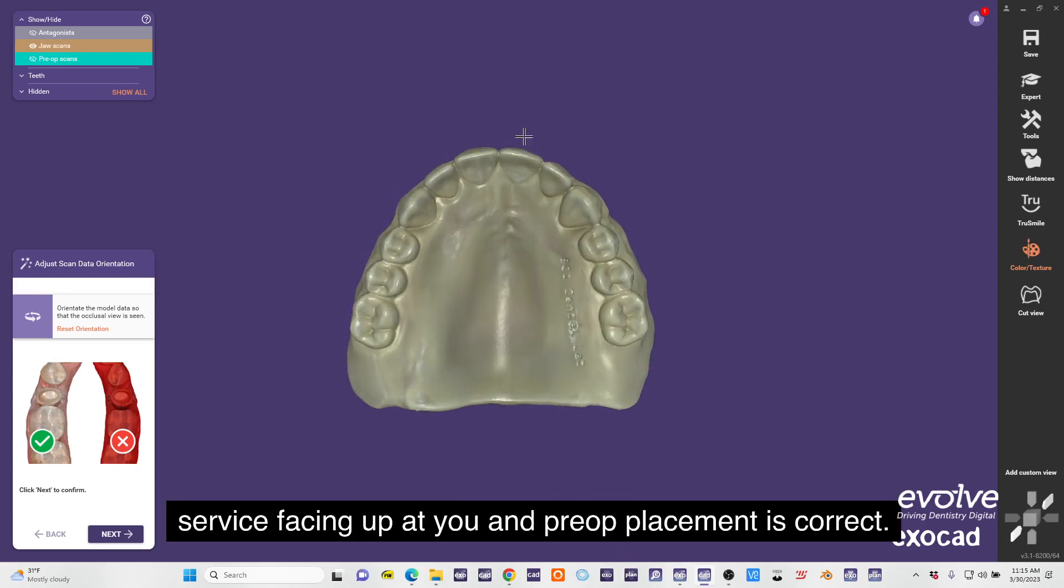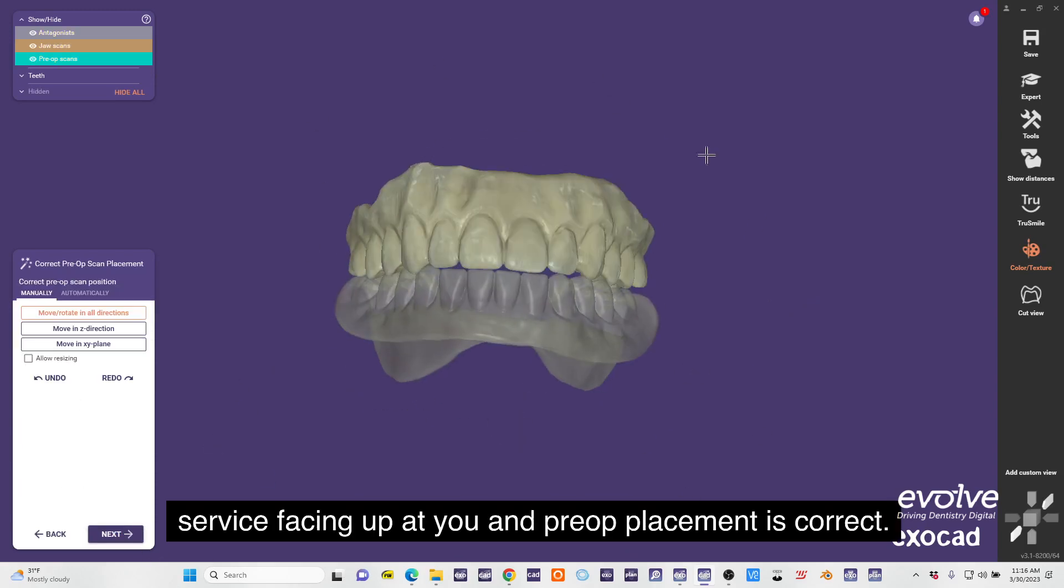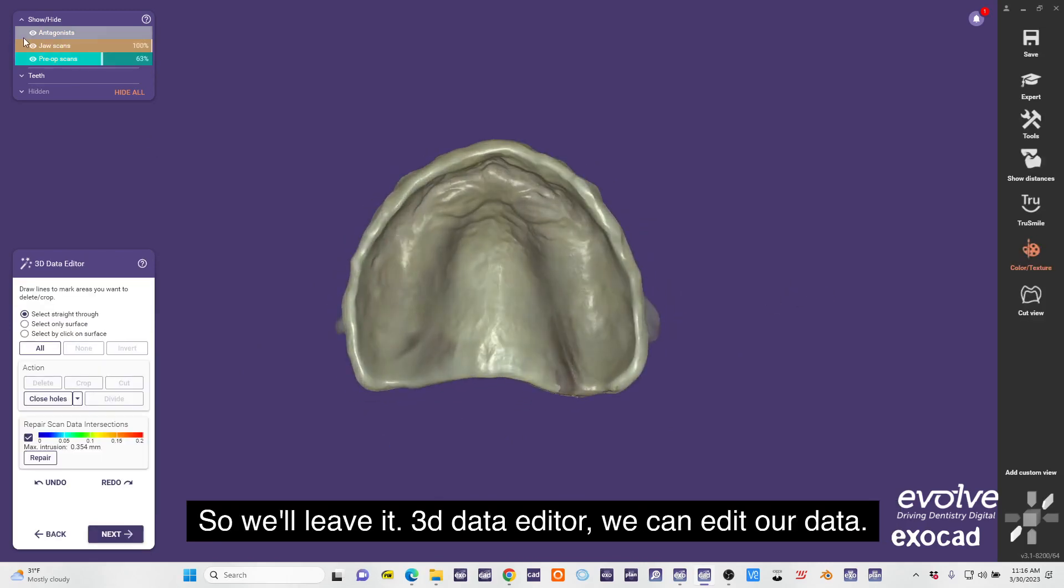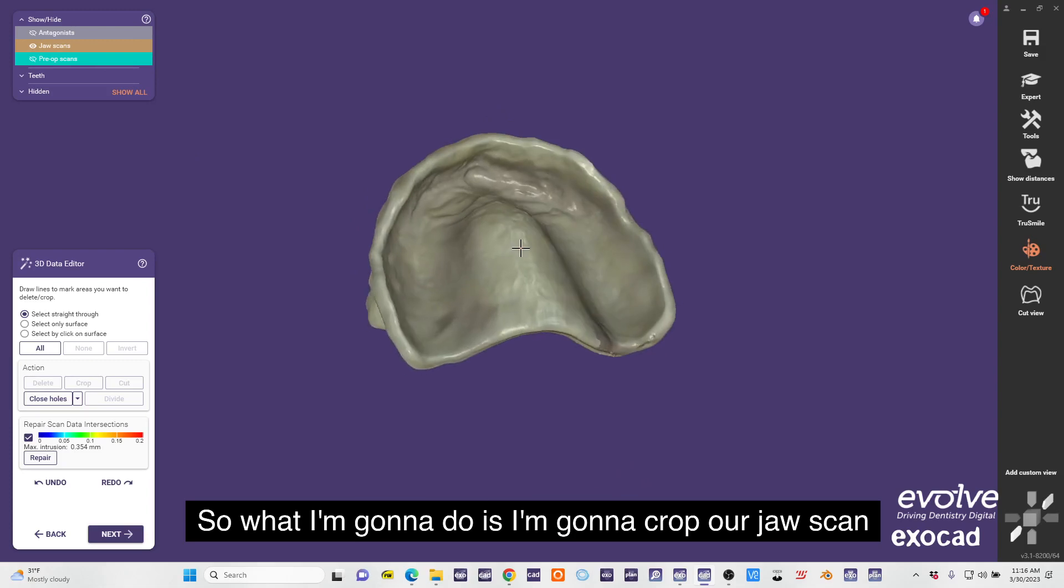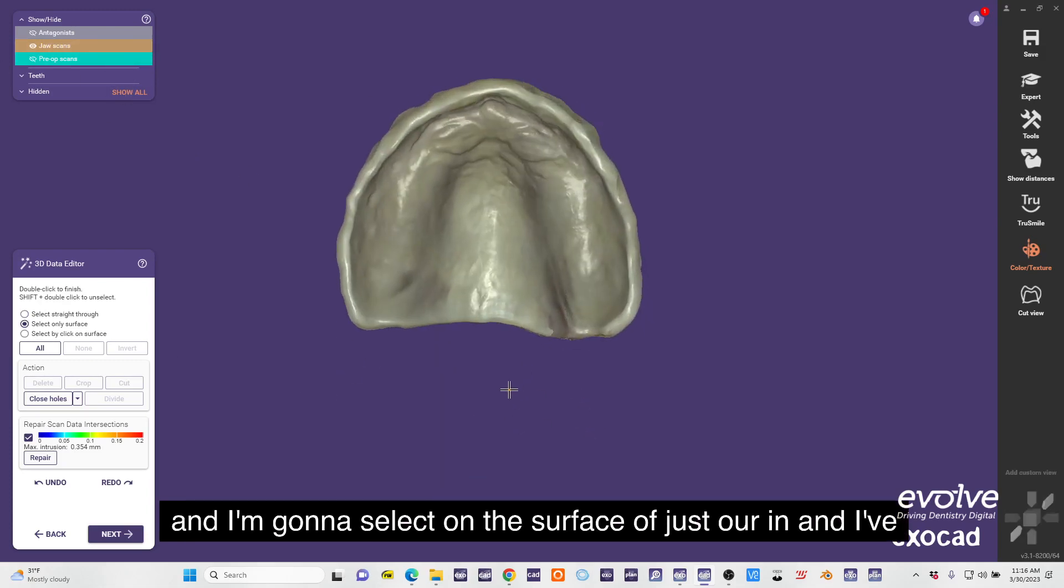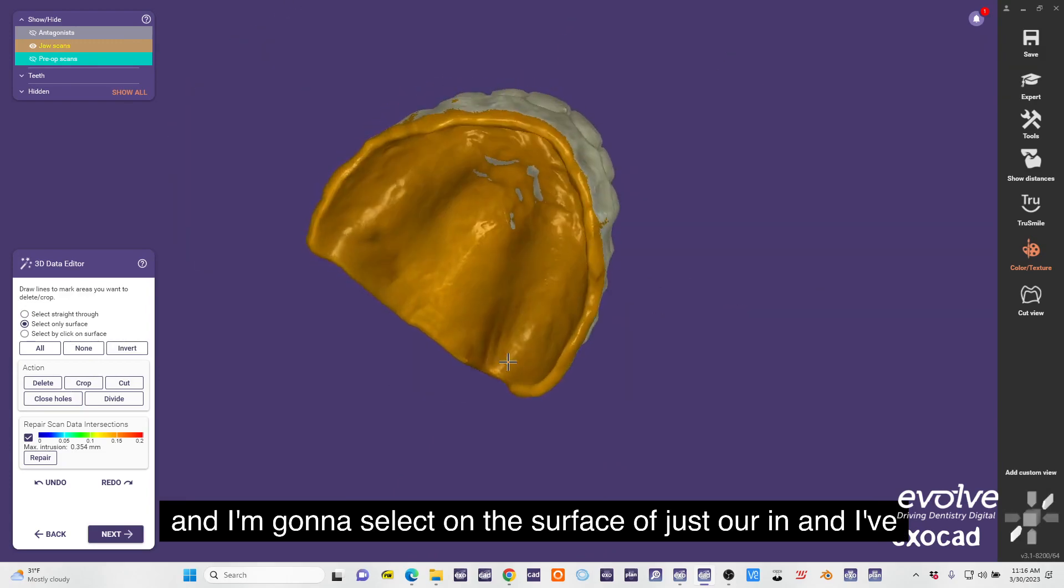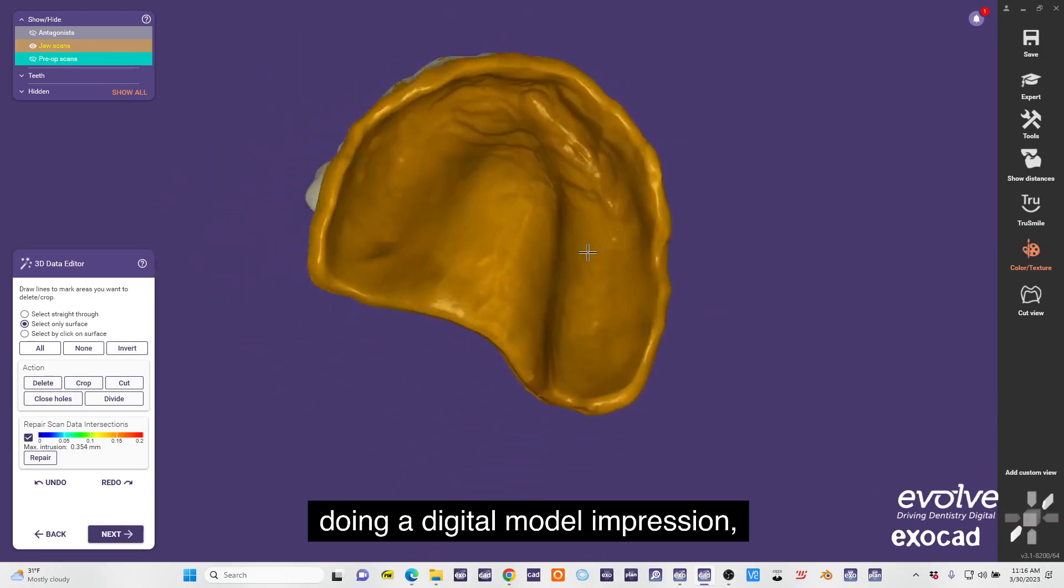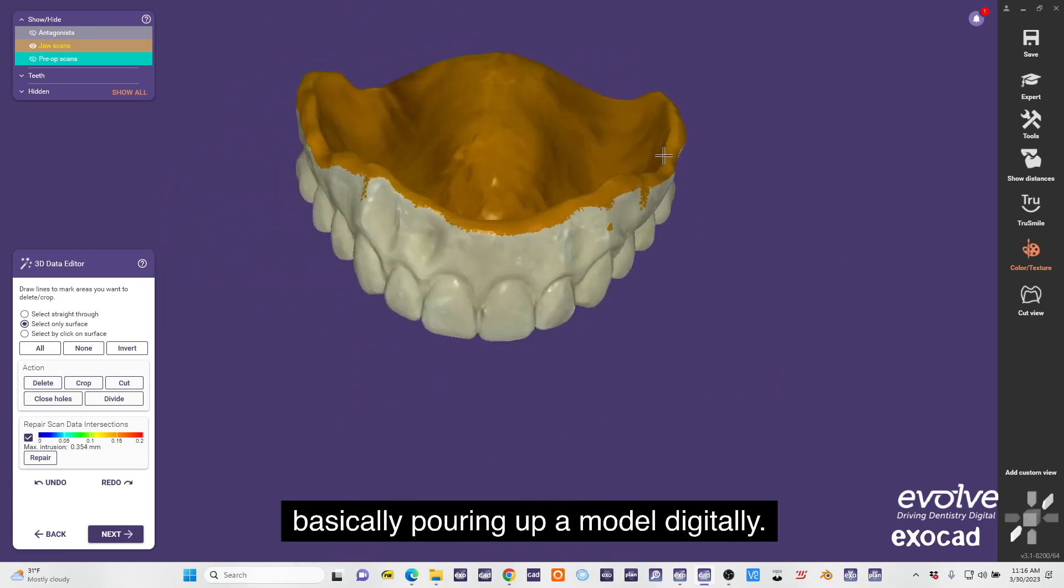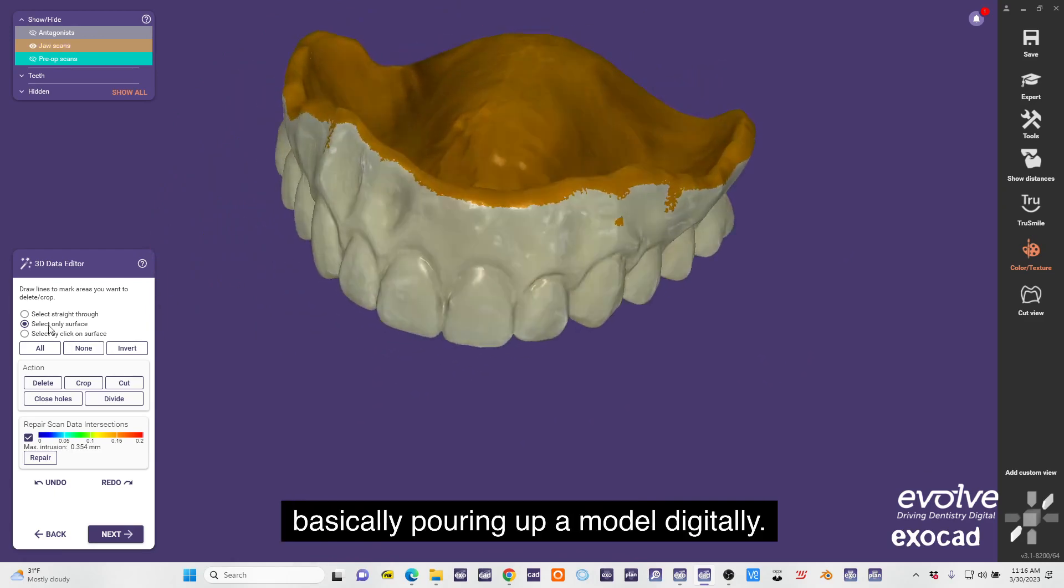Scan data orientation - always have your occlusal surface facing up at you. Pre-op placement is correct so we'll leave it. In 3D data editor we can edit our data. What I'm going to do is I'm going to crop our jaw scan and I'm going to select only surface of just our intaglio. I've only selected just the intaglio surface because I'm doing a digital model impression, basically pouring up a model digitally.